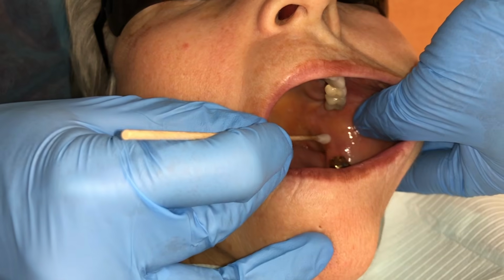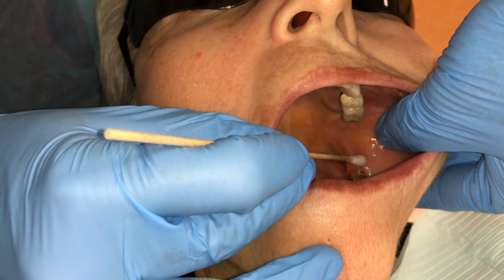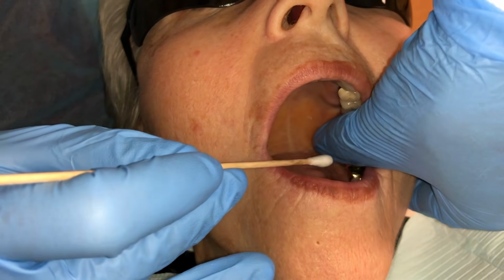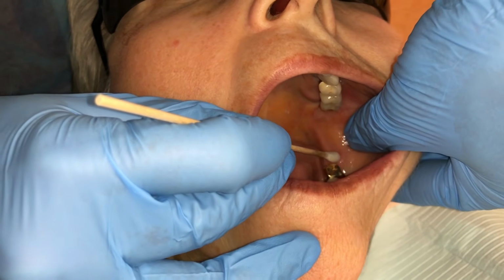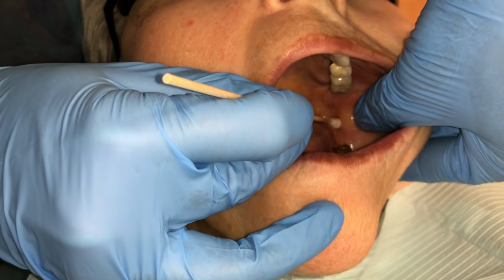The clinician is pointing out the pterygomandibular raphe in the video. The thumb is placed on the greatest concavity of the coronoid notch, pulling the tissue tightly. A Q-tip can be utilized to identify the penetration location.